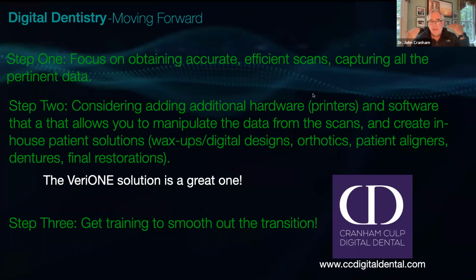And the other thing that I will tell you is with the Keystone Soft material, I tend to wrap, like if your splints are loose, I'll see that sometimes. If the splints are loose, I will go up the facial contour of the teeth a little bit more, so that when the Keystone Soft goes in, it's engaging both the lingual and a little bit of the buccal undercuts. And since I'm doing that, they really snap in there.